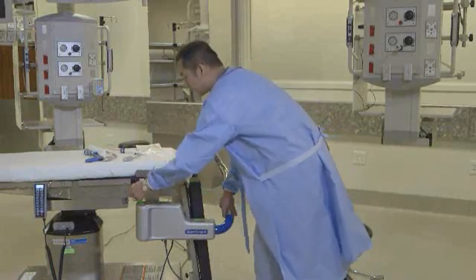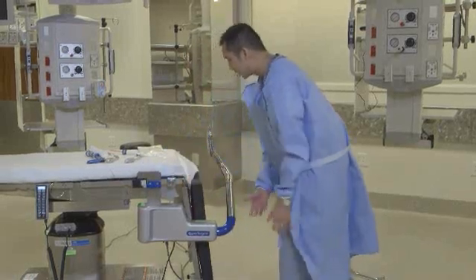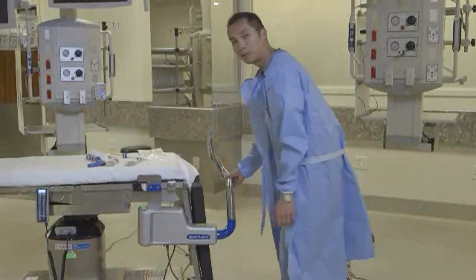I'm going to go ahead and lock this down. This is where your stirrup is, the leg is out here, and now you have the device securely mounted to the bed.